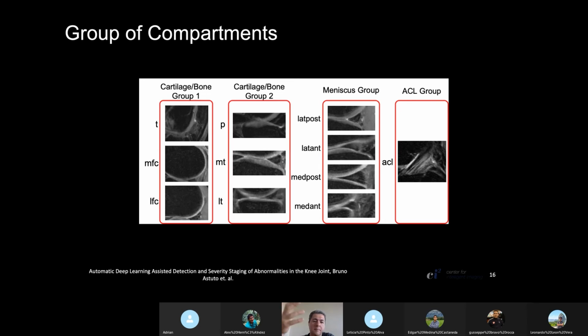They were not the same structure, but we were hoping that by doing that, the features in the image that belong to the lesions of the cartilage, like markings in the cartilage, would be similar in shape, and the geometry of the features of the lesions would be the same.